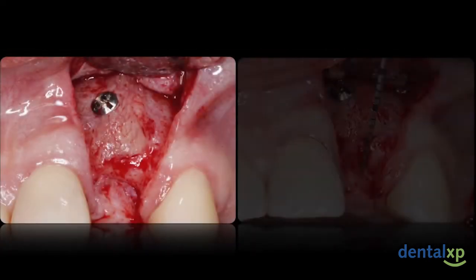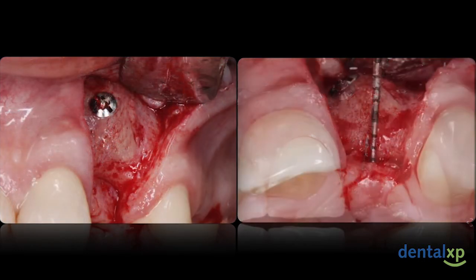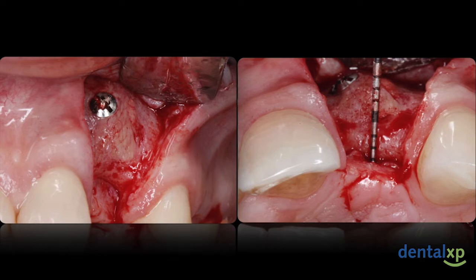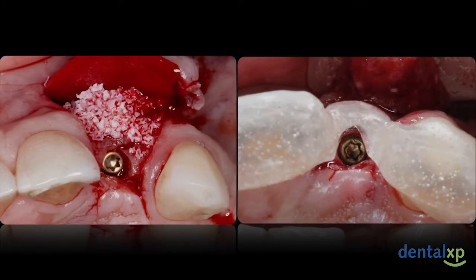Our observations for the autogenous site were slightly different. The graft clinically appeared well incorporated, but the surface of this graft appeared to have undergone some form of remodeling, however within normal limits, despite the addition of the membrane to the site. Nevertheless, we were able to achieve sufficient volume to adequately place our implant, as well as good dense bone quality, which sometimes may be tempting for us to try to achieve high initial insertion torque, but we have to take into account that the seam of this graft may still be weak, and caution has to be directed to avoid overstressing the graft site to avoid any fractures that may occur at its weakest link.